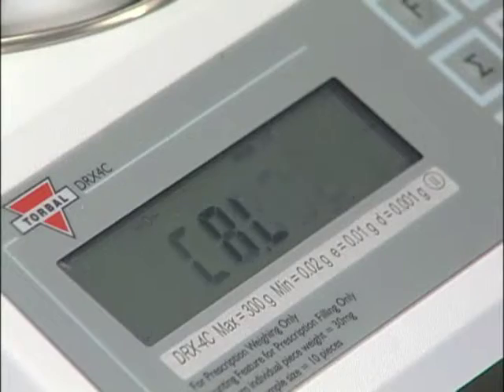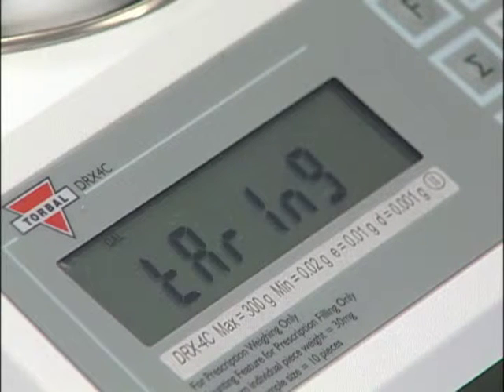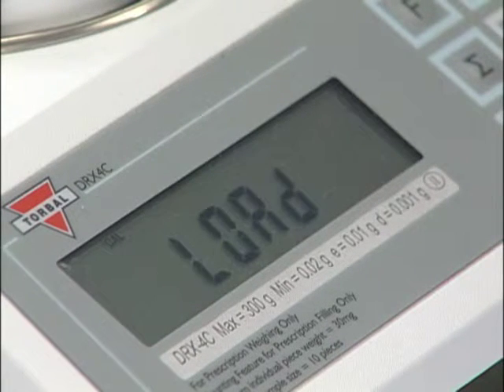The scale will enter the calibration mode and perform a tare. Once the scale has finished taring, the display will indicate you should load a precision calibration weight.